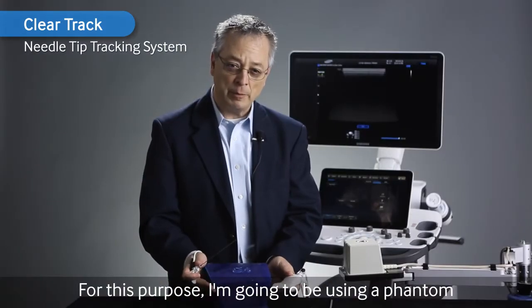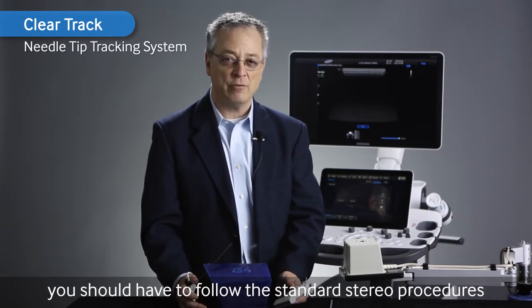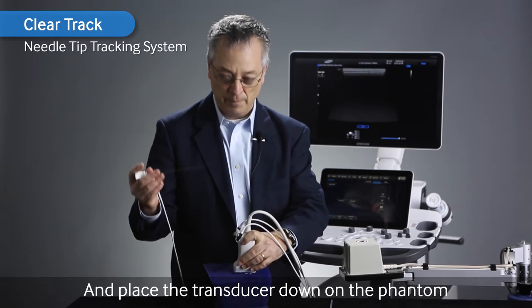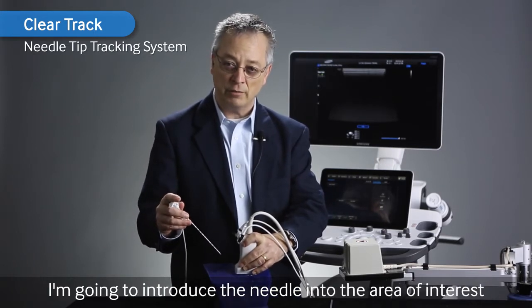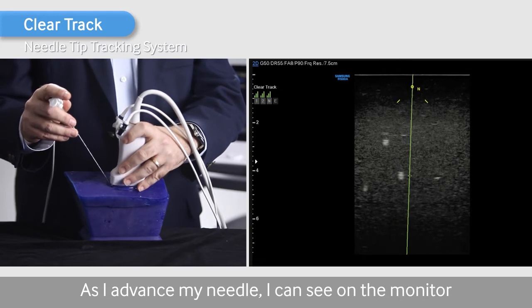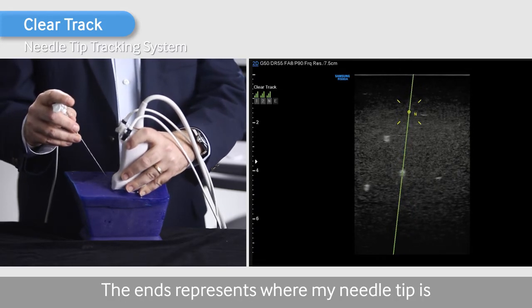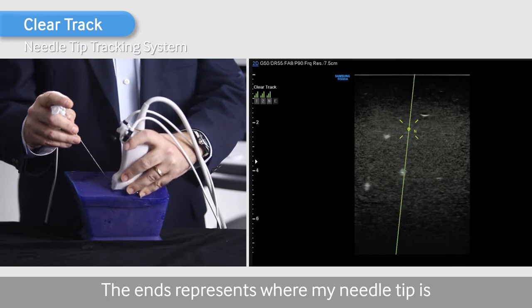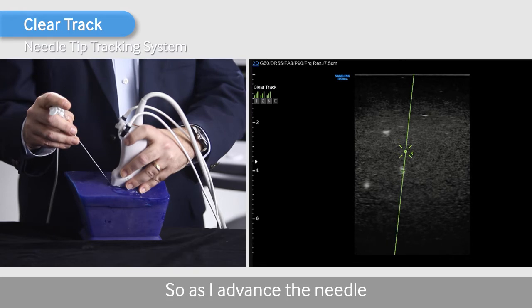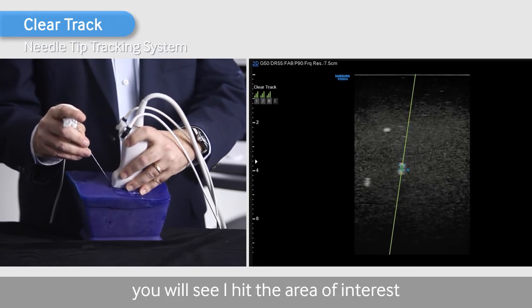For this purpose, I'm going to be using a phantom. For a regular procedure, of course, you'd have to follow the standard sterile procedures. In placing the transducer down on the phantom, I'm going to introduce the needle into the area of interest. As I advance my needle, I can see on the monitor how the graphic will help guide me to where I need to be. The N represents where my needle tip is, where the plus represents where my target area would be. So as I advance the needle, you see I hit the area of interest.